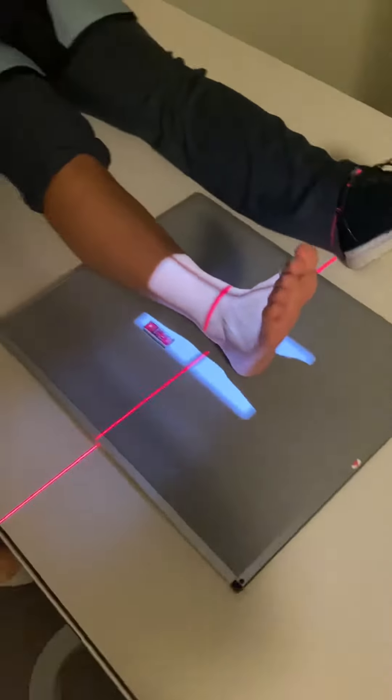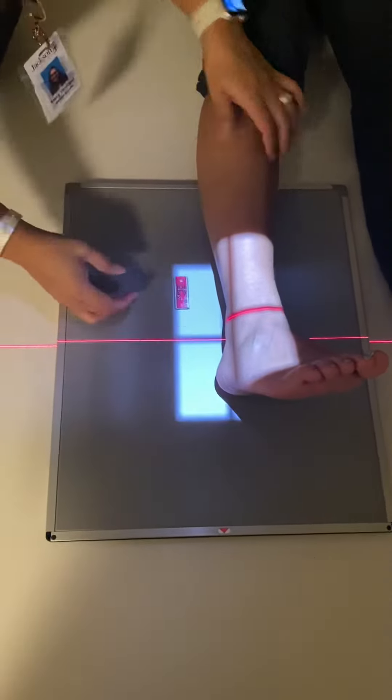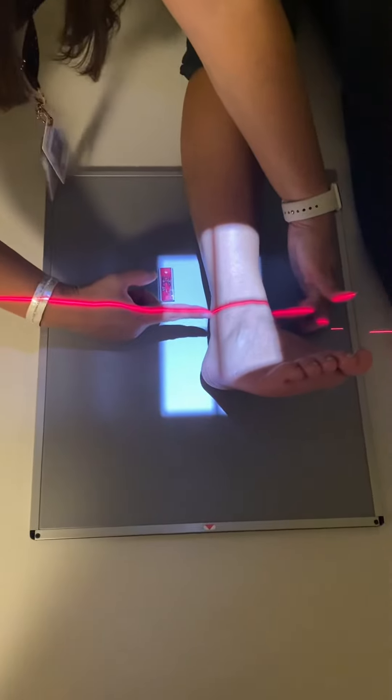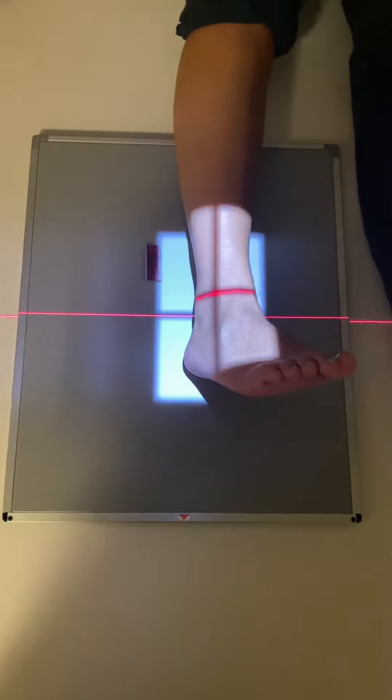Then for the Mortise, you're going to internally rotate 15 to 20 degrees. You want to make sure the whole leg goes, not just the foot. Now your malleoli should be equal distance to the IR, and you're still centering midway between the two.